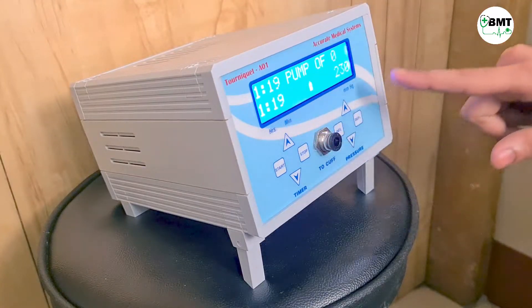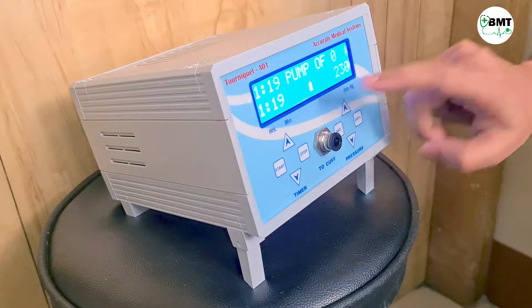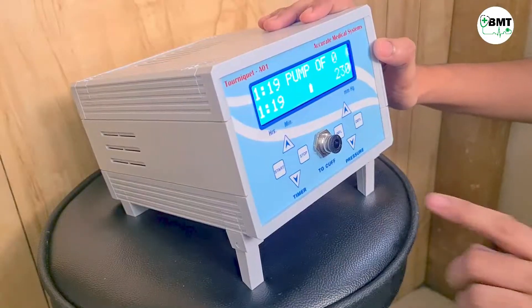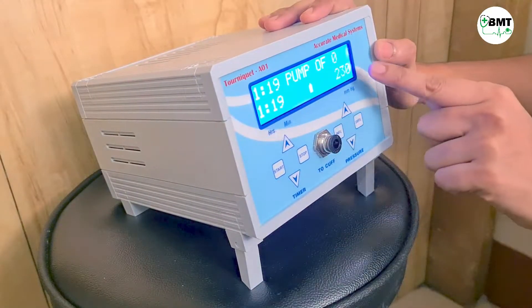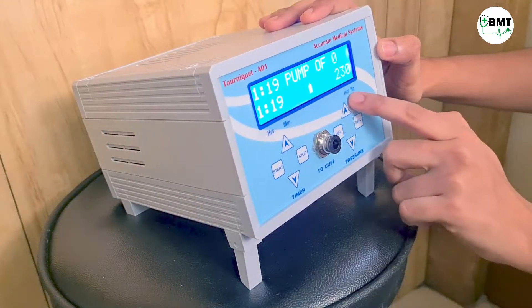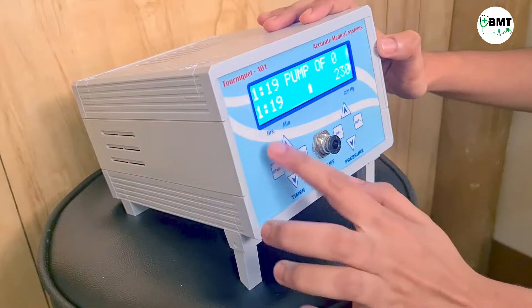Once you turn on the machine, this screen will appear. This is the battery symbol — the machine has battery backup. This is the main indicator, this is the timer, and here is the pressure display showing time in hours and minutes, and pressure in mmHg.